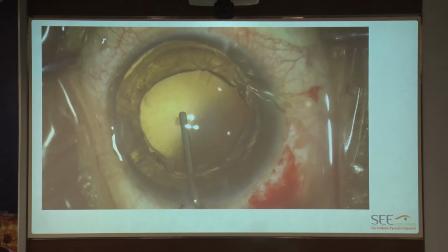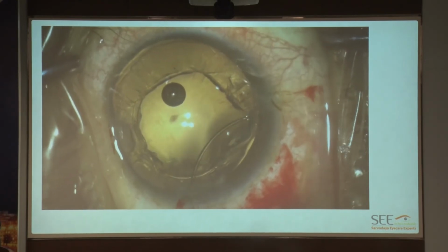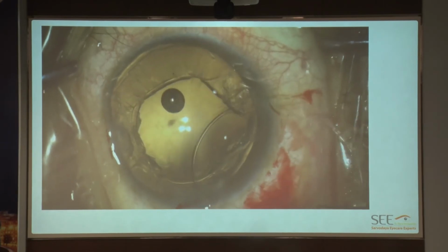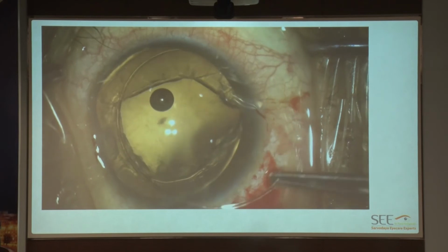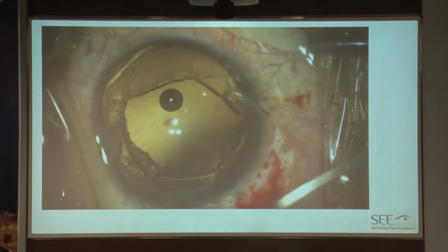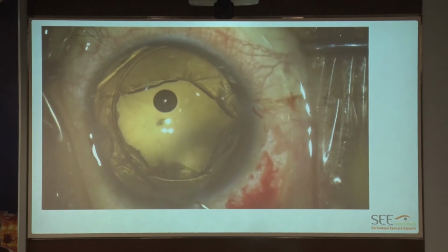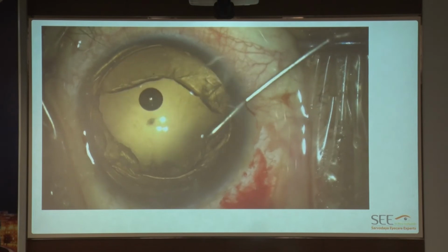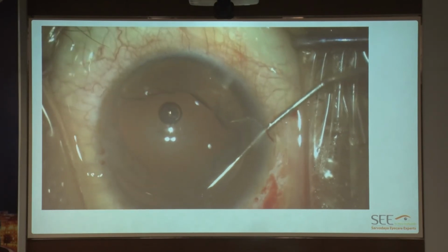Here now I'll be putting in an endocapsular ring, because I usually prefer to do that before the cortex wash. Always avoid the acute angle. Try to see which position will cover most of the zonular area, because in my initial days I made the mistake where the area of zonular laxity did not have complete endocapsular ring coverage.